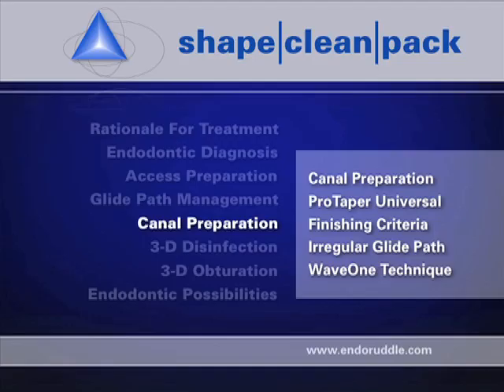I appreciate your attention, and I'm sure if you're not already a ProTaper user, you're going to find these instruments extraordinary in their ability to carve out a smooth, reproducible shape that's conducive for any dentist to fill in 3 dimensions.